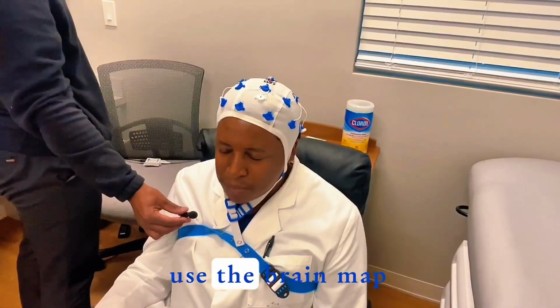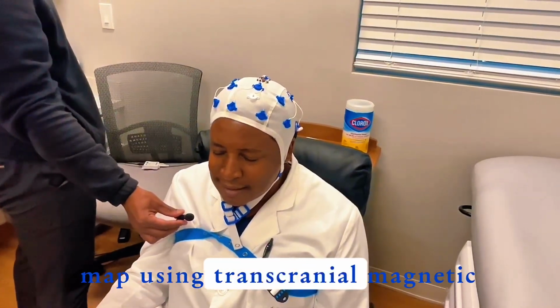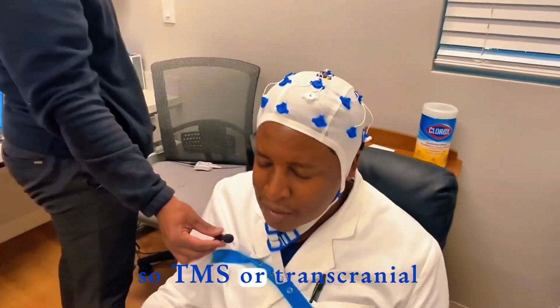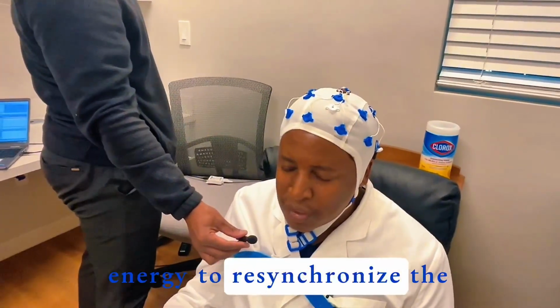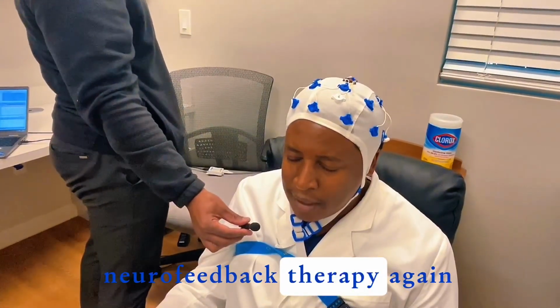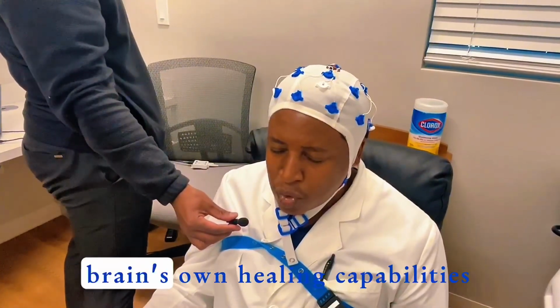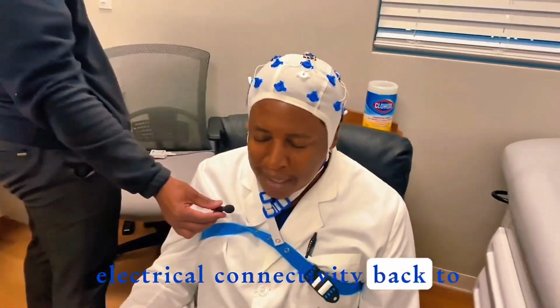For example, we can use the brain map for generating a treatment map using transcranial magnetic stimulation. We call it MERT therapy. So TMS, transcranial magnetic stimulation, guided by a QEEG, we call that MERT therapy. So gentle pulses of magnetic energy to resynchronize the disrupted brain. The other thing we can use this brain map for is a treatment called neurofeedback therapy. Again, understanding brain electrical connectivity and then using the brain's own healing capabilities to redirect electrical connectivity back to normal.